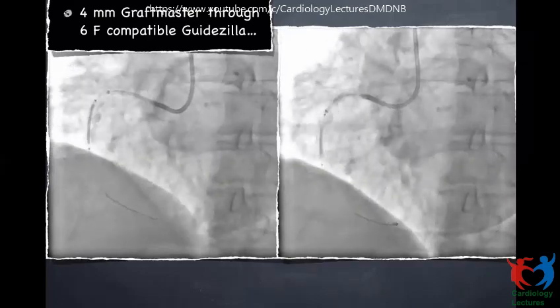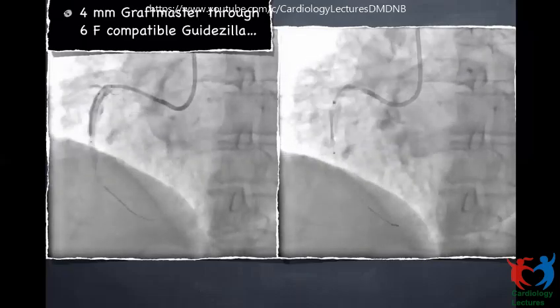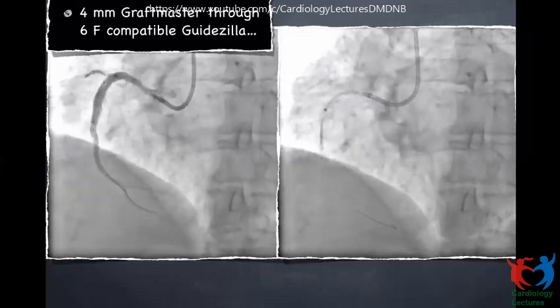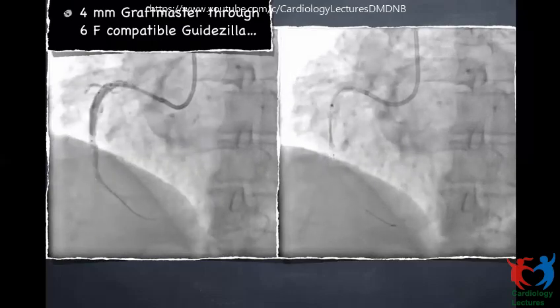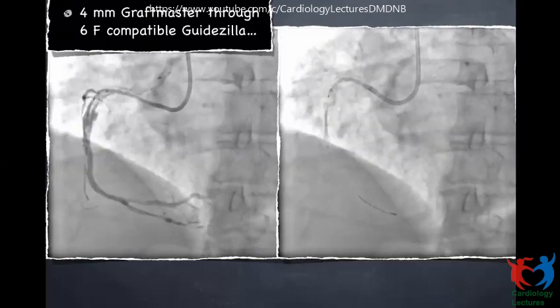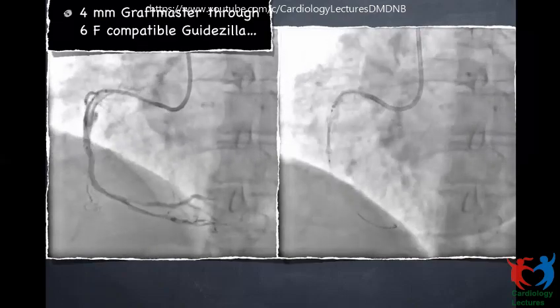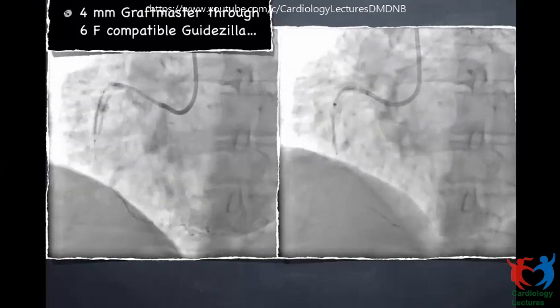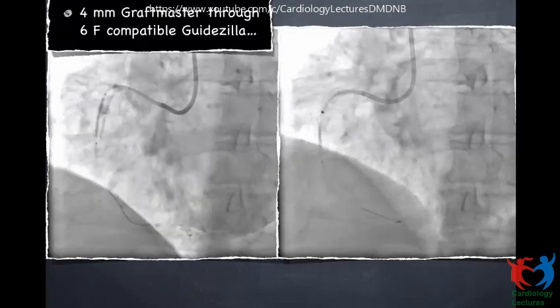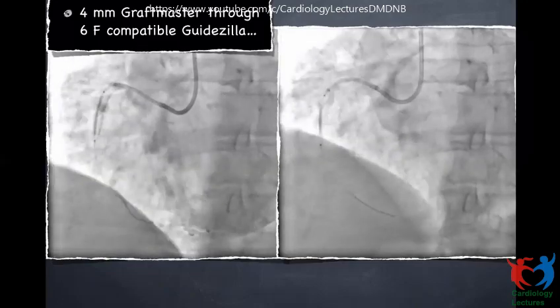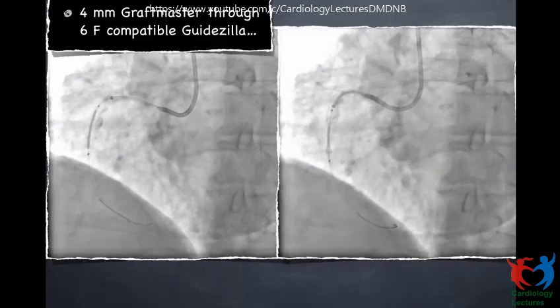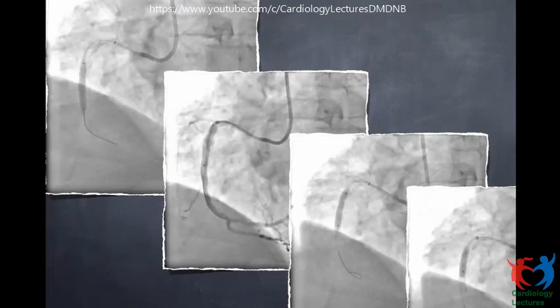During deployment, the guide catheter — which had been just outside the coronary ostium — slipped inside the coronary as we were pushing, causing the GuideLiner and the stent to move distally. We partly dilated the stent before realizing it had moved distally, stopped, tried to pull it back, but it was not possible with a partly dilated stent. We had to deploy the stent distally, missing the perforation site. As expected, the perforation was still persisting.